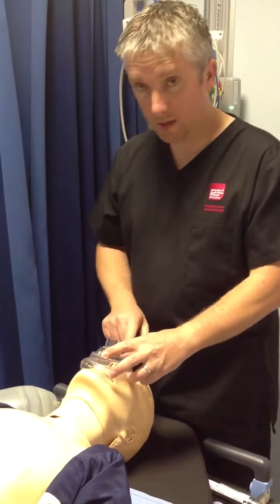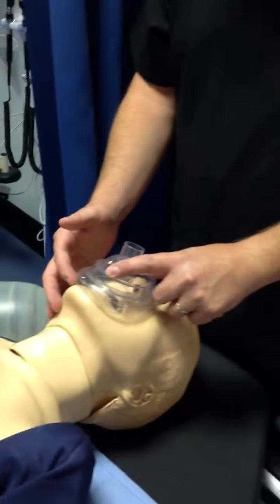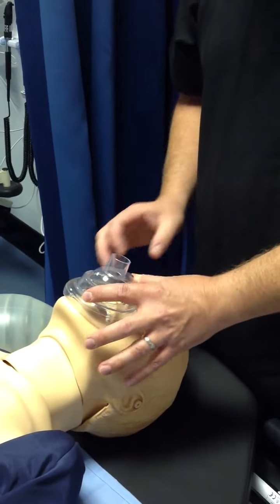You place the apex of the mask on the patient's nose, making sure that the bottom of the mask doesn't overhang the chin and also making sure that the mask covers the mouth and the nose.